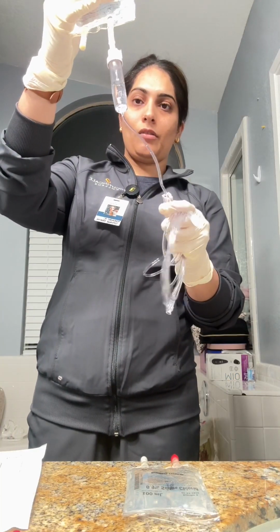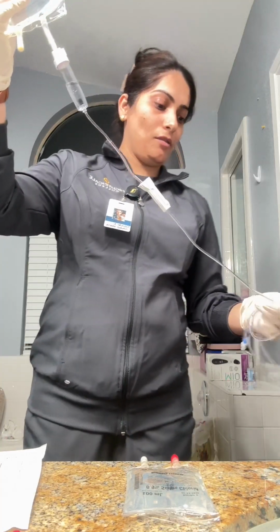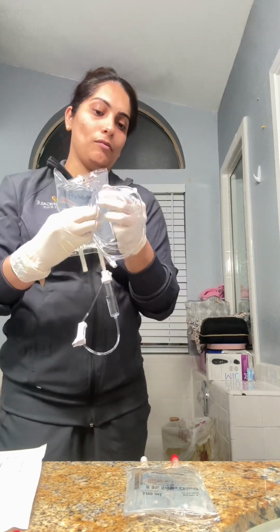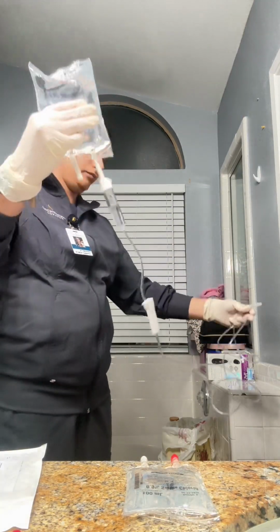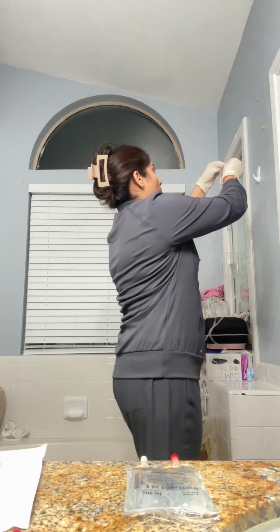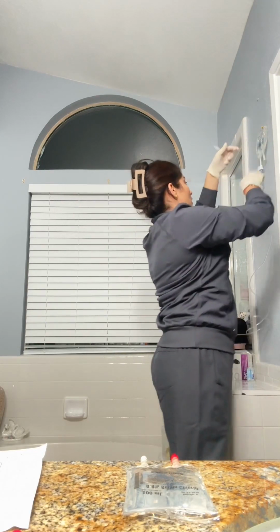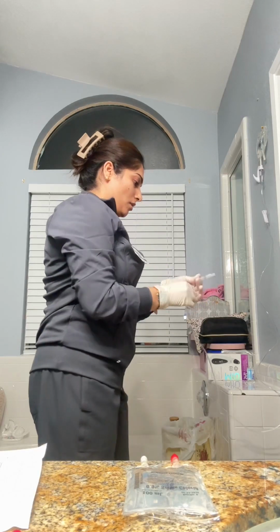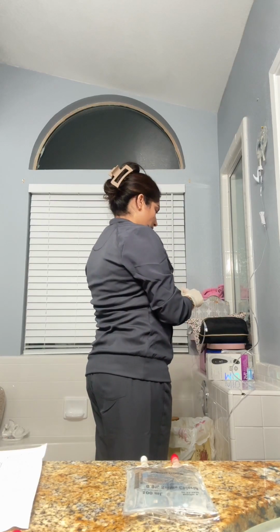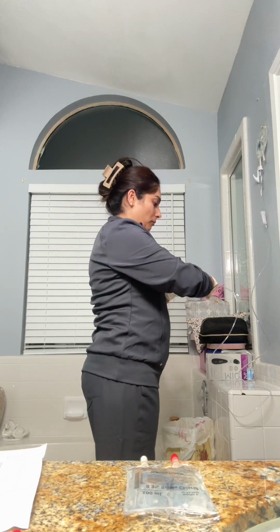And then we're going to clamp this right here, this one right here, and I will be counting the drops right here for a full minute.